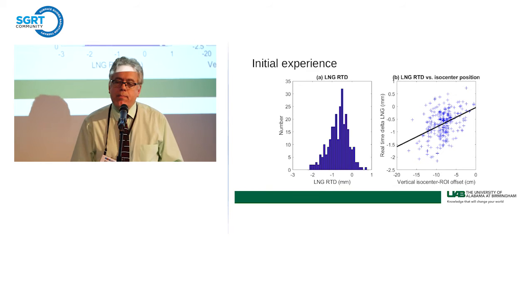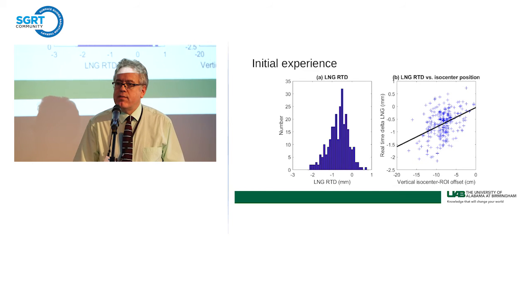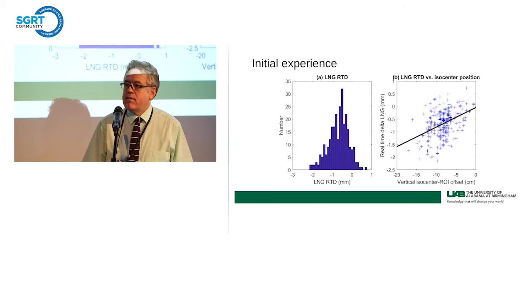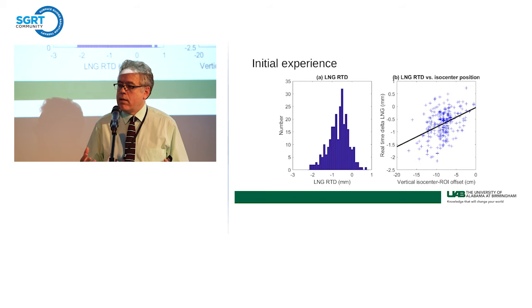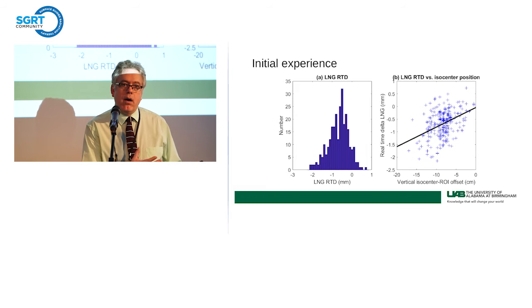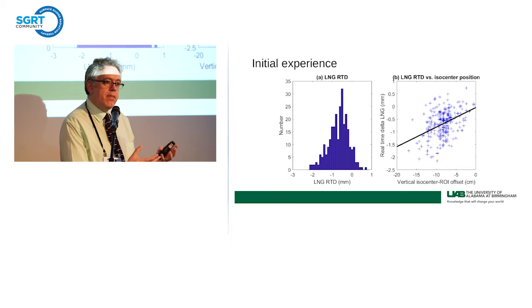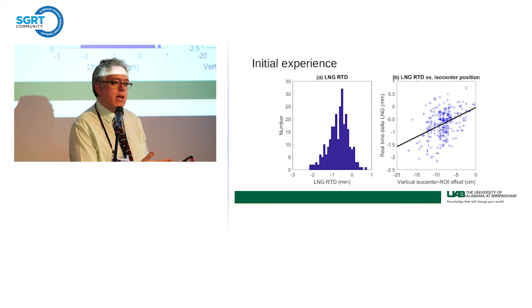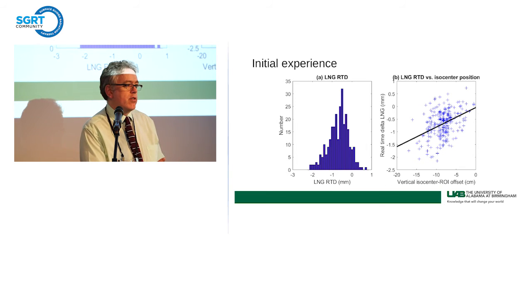So I believe it was in late 2017, just after AAPM last year, Vision RT came to our center and applied what was called advanced camera optimization to our cameras. And the way I understand that is the cameras have a model of the optical path in that camera. And that's used in the software to then create the depth map and then the 3D surface.